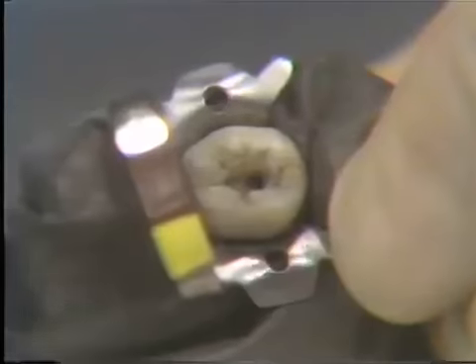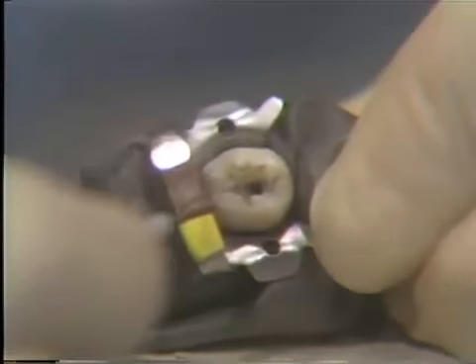To get into the mesial buccal canal, you come from the distal lingual and it slides right on in. To get into the mesial lingual, you come from the distal buccal and you'll get right on into your canal. And to get into the distal canal, or canals, you come in from the mesial. And if you're checking for two canals, which you should, you come from the mesial buccal and then the mesial lingual. Make sure that you have only one canal, or if you have two canals, that you'll find them.